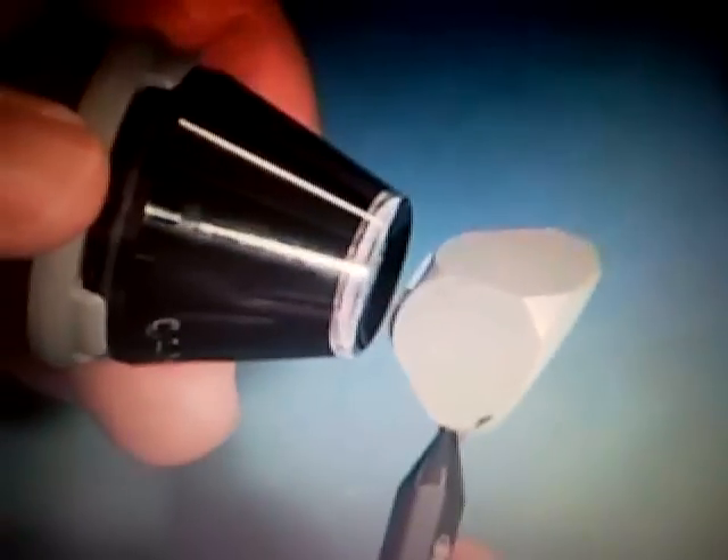In the four-mirror lenses, all four mirrors point towards the iridocorneal angle. There are no mirrors that are designed to look at the peripheral retina. These lenses have a small area of contact — you can see cornea around the lens when it's being used — and they have a relatively flat area of contact.